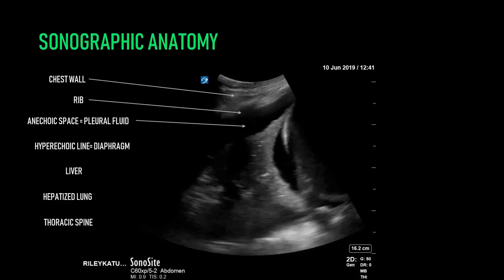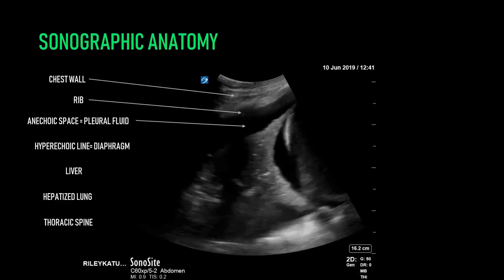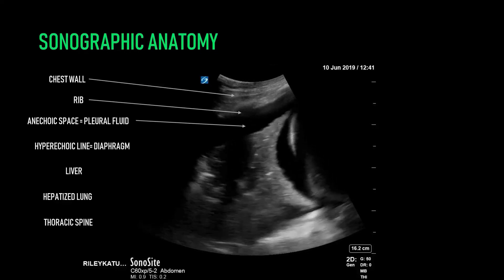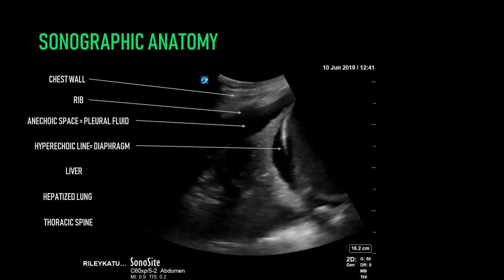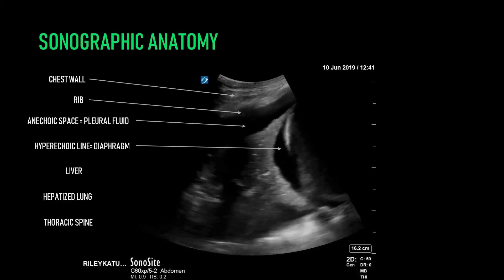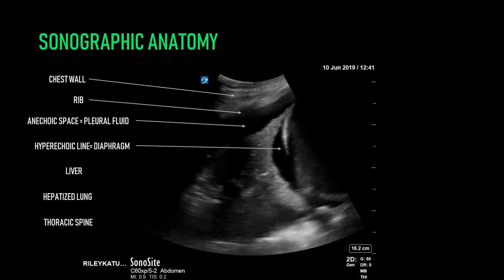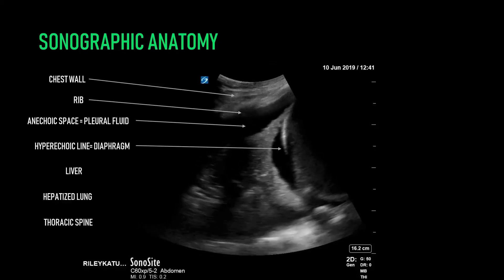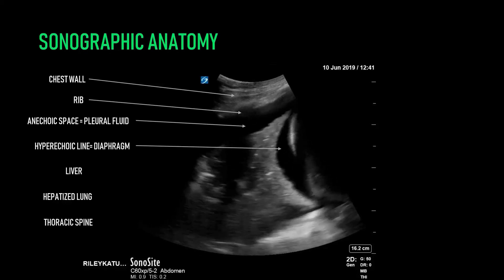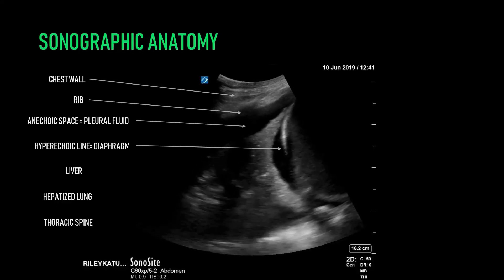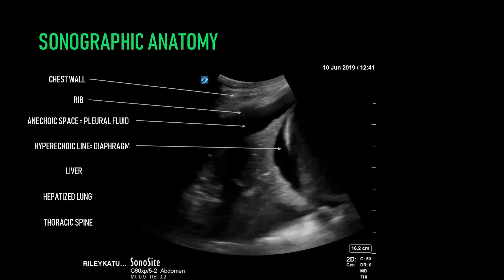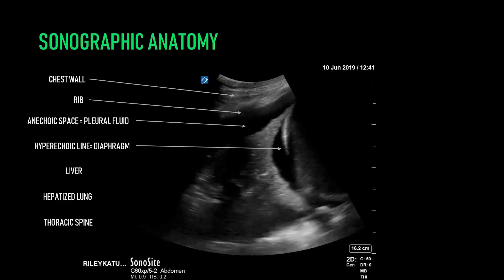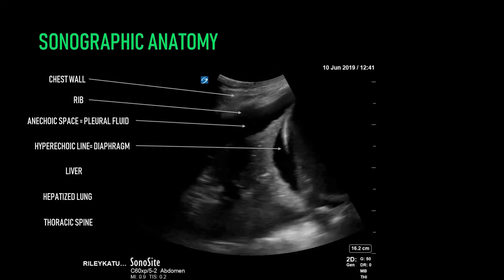The next crucial feature to identify when considering placing a chest tube is the diaphragm. This is denoted by a hyperechoic line in the part of your ultrasound field that corresponds to the direction of the patient's feet — in this case on the screen right. Immediately caudad to the diaphragm, you should see tissue density marking out the liver. Cephalad to this, you may see pleural fluid or the lung.